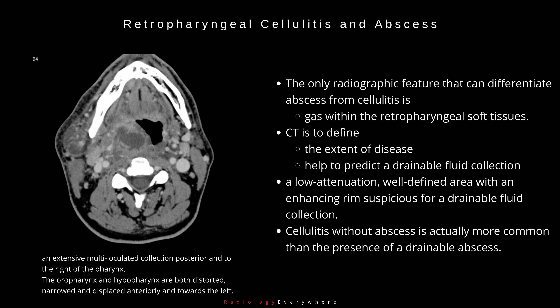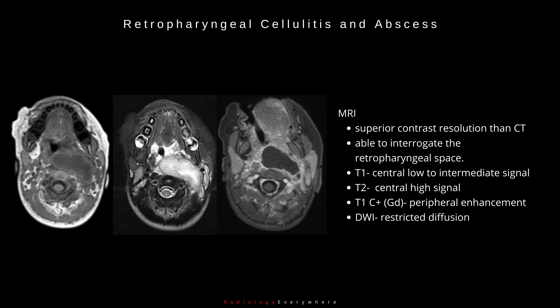The only radiographic feature that can differentiate abscess from cellulitis is the identification of gas within the retropharyngeal soft tissues. CT is used to define the extent of disease and to help predict cases in which a drainable fluid collection is present; it shows a low attenuation, well-defined area with an enhancing rim suspicious for a drainable fluid collection. MRI has superior contrast resolution than CT: T1 images show central low to intermediate signal, T2 images show central high signal, T1 with gadolinium shows peripheral enhancement, and DWI shows increased values indicative of restricted diffusion.